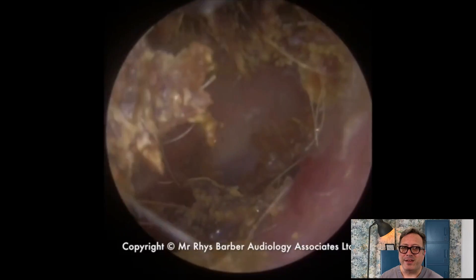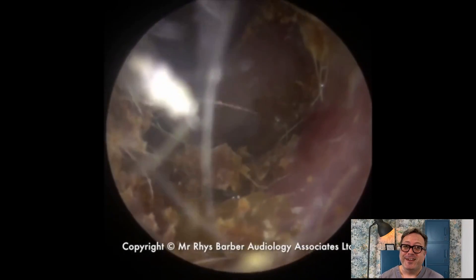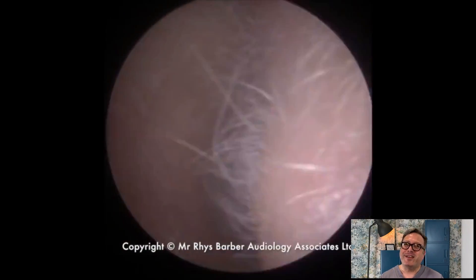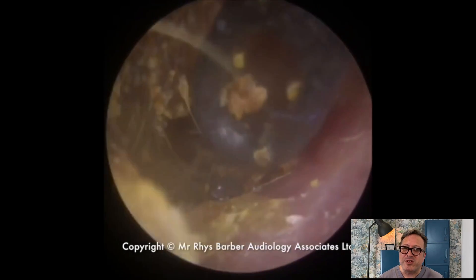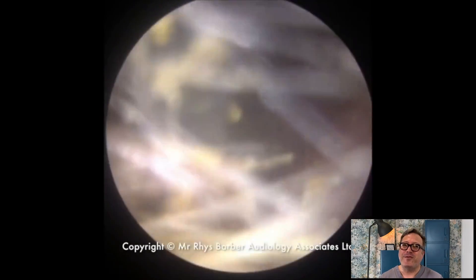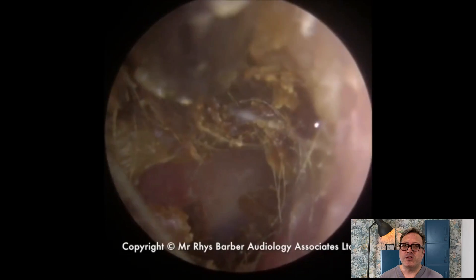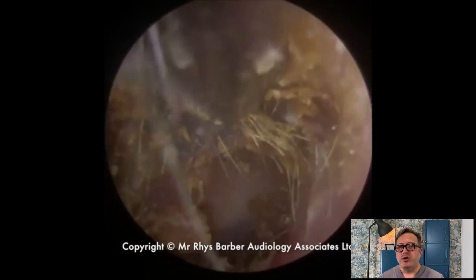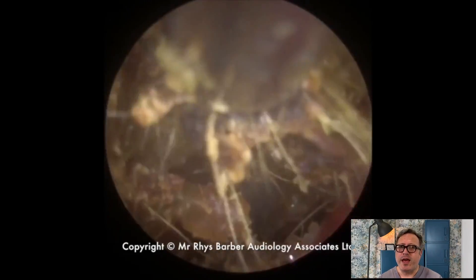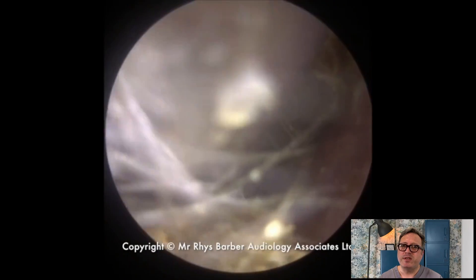There we go — we can start to see the eardrum now. What we've got is effectively a ring of dry wax around the outside edge. These earlier videos were kind of firsts for the channel — the first time we saw really dry, difficult earwax — so it's quite nice to go back over them. We're going to go over with the Zolna tube now just to pull this section down. You can see the skin under there, see it peeling away — you can see why it dried onto the canal the way it has.